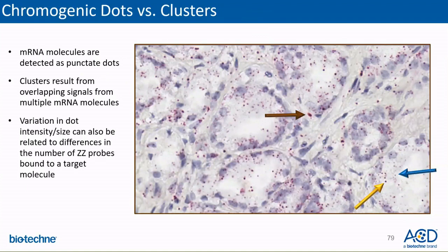The slightly larger, darker red punctate dot shown by the yellow arrow is also one mRNA molecule. However, it is larger in size as more ZZ probes have bound to the target molecule. In contrast, a cluster shown by the brown arrow is oblong with a slightly irregular border and is the result of overlapping signals from multiple mRNA copies.